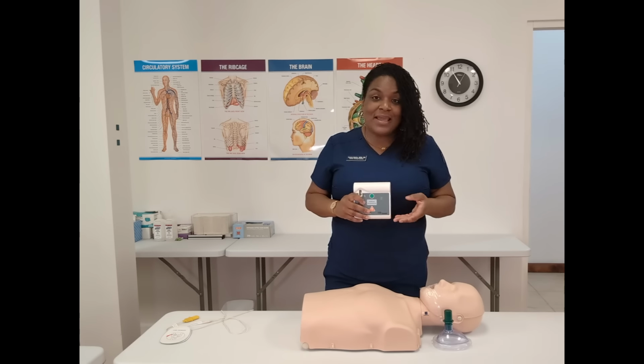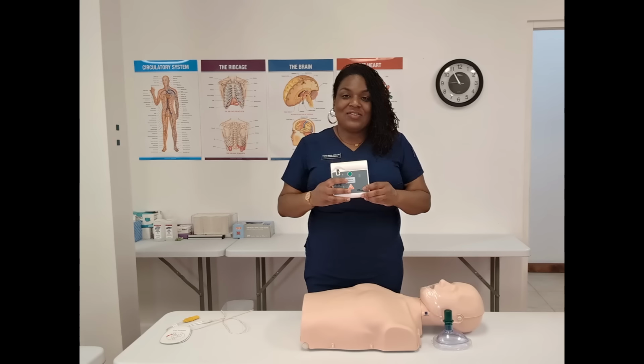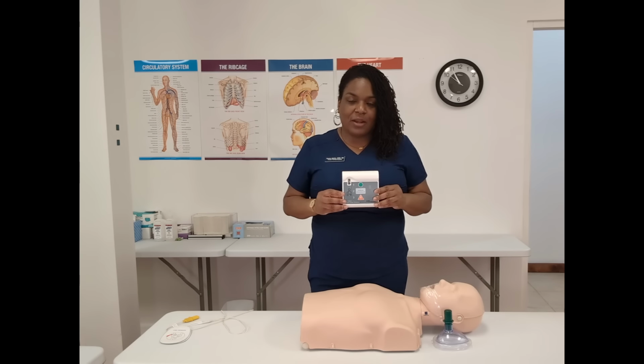And a lot of people say, well, we have employee health or we have the nurse. And my question is, what happens if it's the nurse who's in cardiac arrest? So I need for you to be a responsible adult and go ahead and use the AED that's at your workplace. Learn how to work it, not just the nurse or the healthcare professionals.